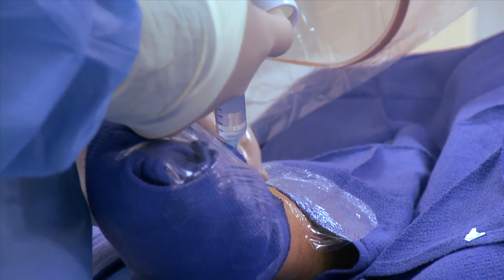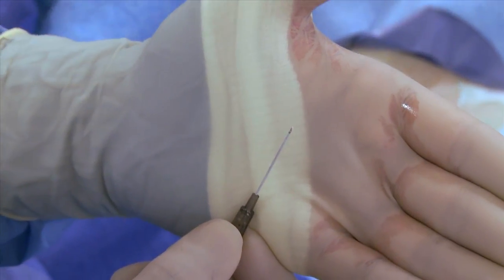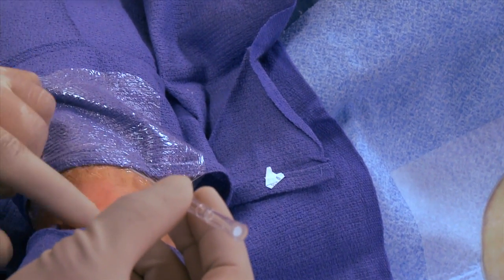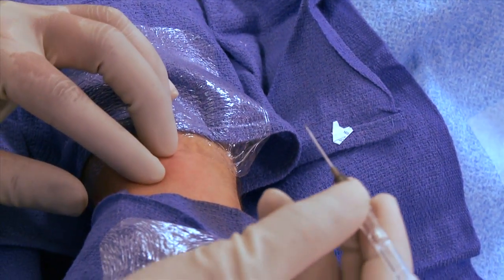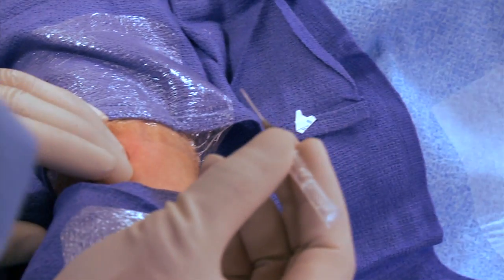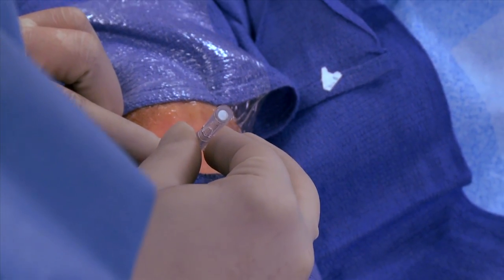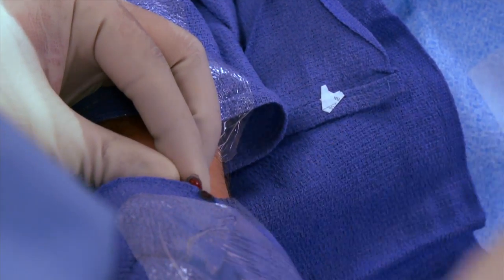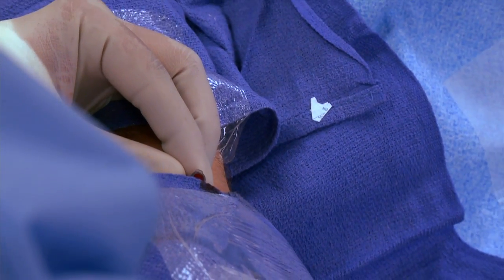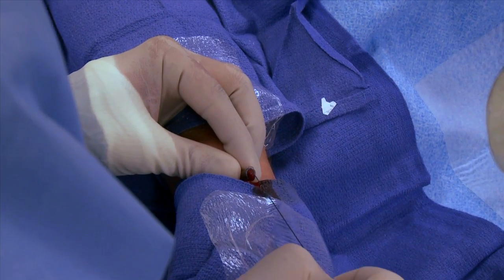Local anesthesia will be applied to your skin, and then we will use a very small needle to access the artery, in this case, in your wrist. Once we feel the artery, we insert the needle, and once in the correct position, we will then insert a very thin wire through the needle into the arm.